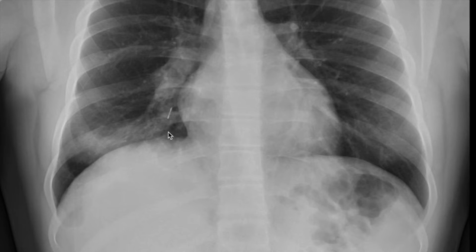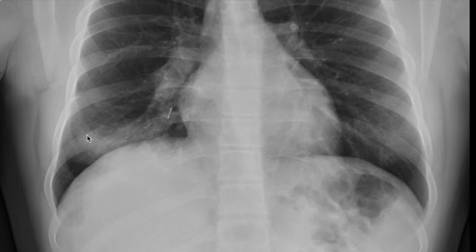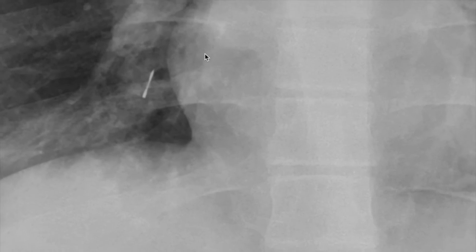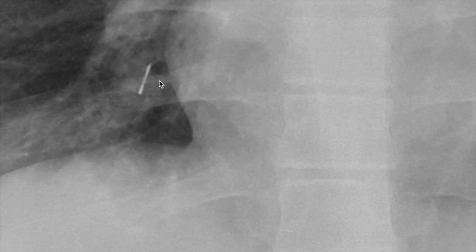The other thing we notice is that in this area of the lung there's an increase in whiteness that is different compared to the left lower lobe, which is normal. This suggests that maybe this is the pneumonia that the patient has presented with. If we just zoom in a little bit, we can get a really good view of this very linear metallic object.